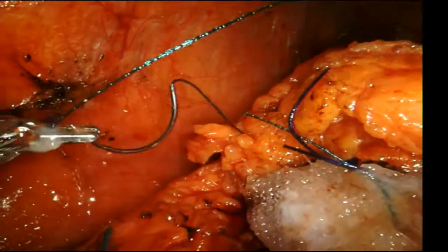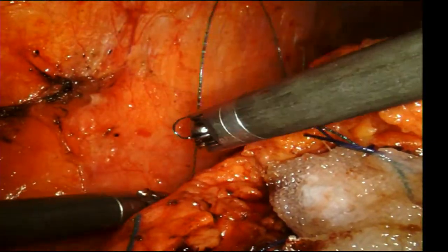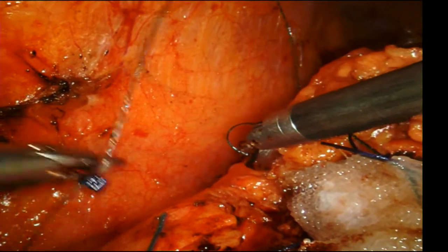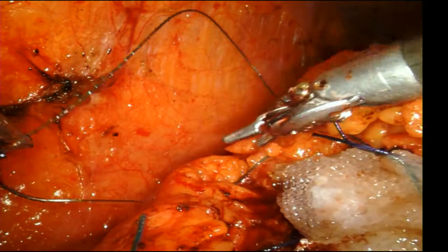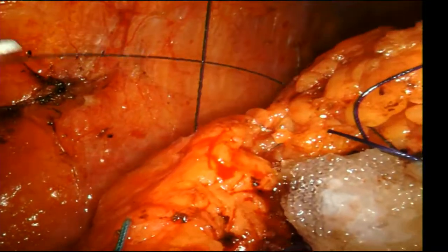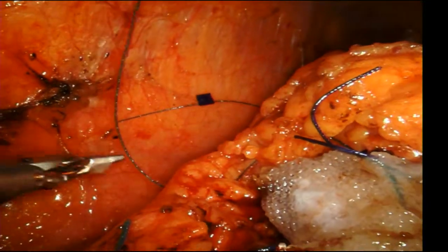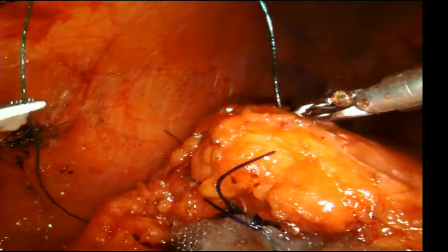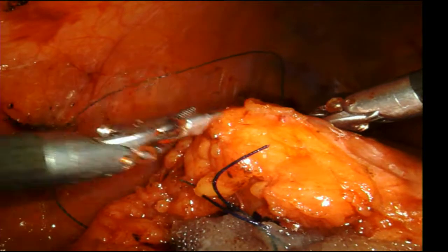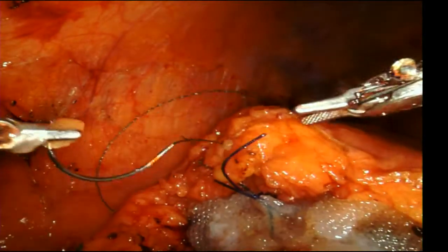When we first did robotic pyeloplasties, that was the rule of thumb, drain. When we first started doing ureteral surgery, drain. You, like you said, nephro-U, drain. Partial cystectomy, drain. Everything was drain. But then over time, we've gotten more and more confident with our ability robotically to get watertight reconstructions to the point that we very rarely use a drain.